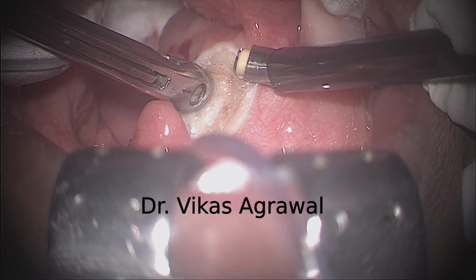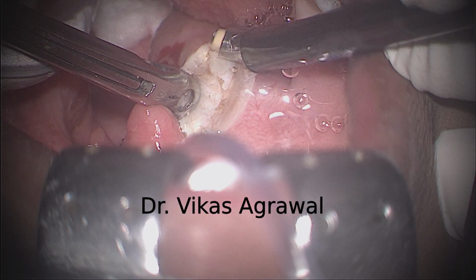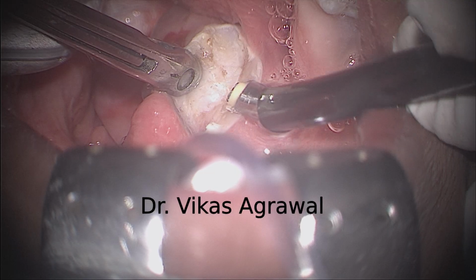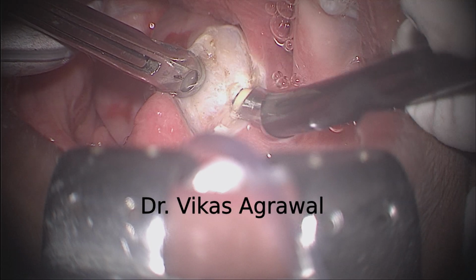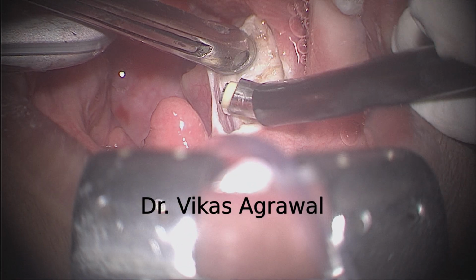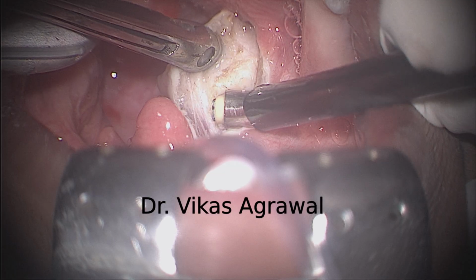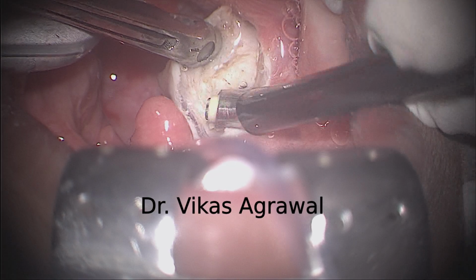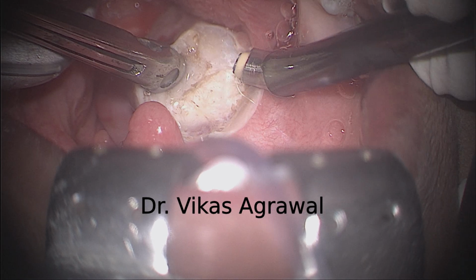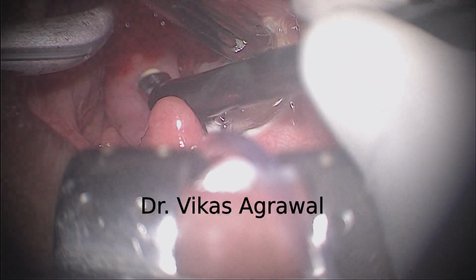Alright, now I will further deepen my plane and try to remain exactly in the plane. See how much of tonsil tissue was inside the pillar.